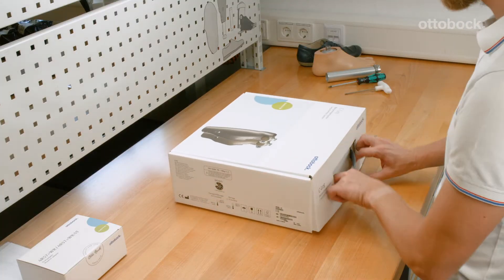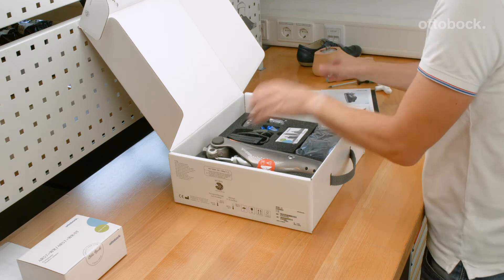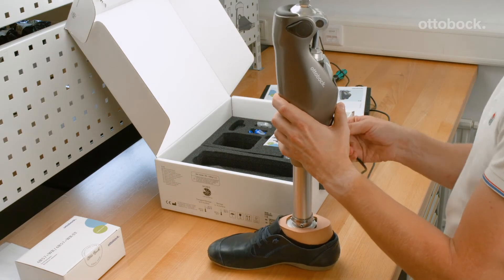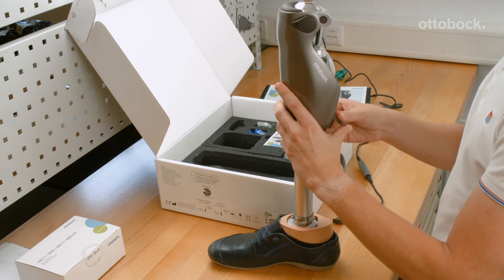Providing the best possible fitting for the user is the goal of every CPO as well as Ottobock. Our microprocessor controlled knee joints adjust their behavior according to the user data entered in the adjustment software.